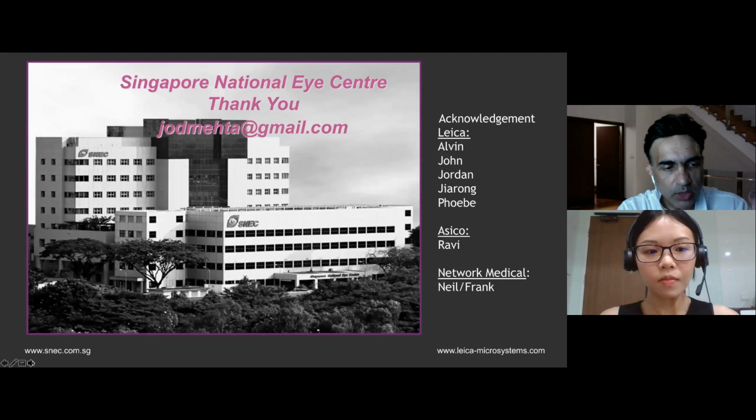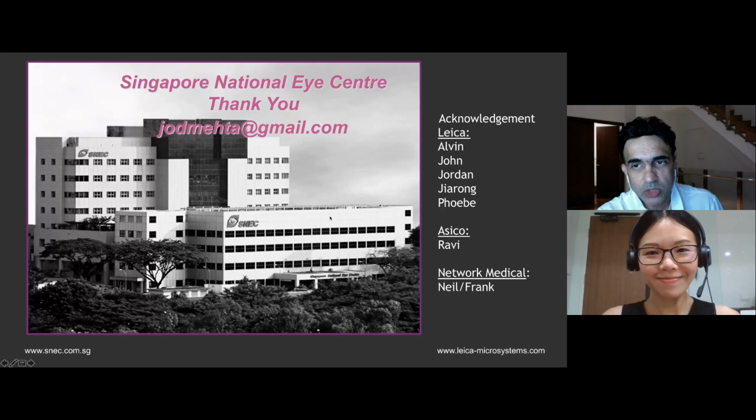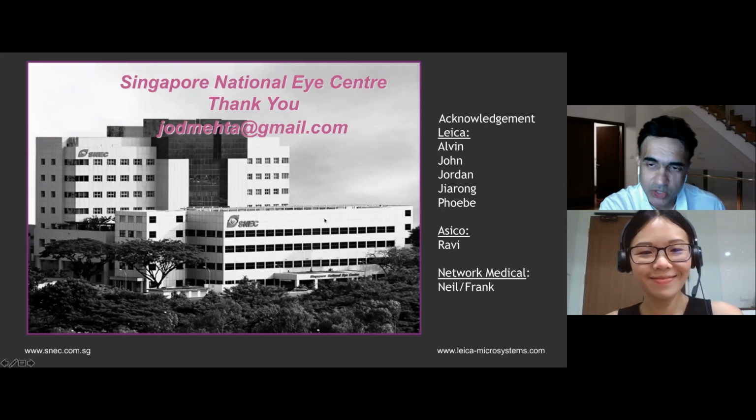I just want to acknowledge and thank everybody at Leica. This is the first time they used the microscope in the OT, so I think all these guys were very patient with me, shouting at them to get the images done correctly and try to get the scans.